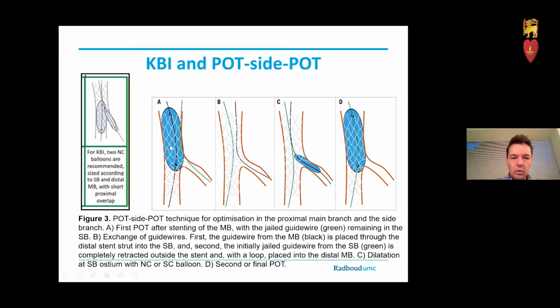So this is what we call not anymore kissing balloons, but we can replace that with a POT-side-POT strategy. Any questions at this moment?